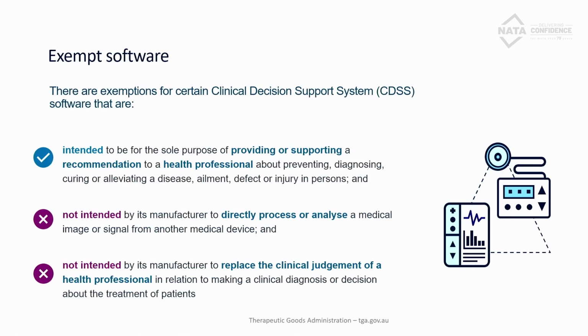Okay. So I'm going to go through in a little bit more detail about some of the exemptions and the exclusions. So there's only one type of exempt software. So that's clinical decision support software. So CDSS are software technology products that support or enable clinical practice. They're used for aggregating and displaying data, providing prompts or reminders, and they help a practitioner in implementing established clinical practice guidelines. So they don't replace the role of the clinician.